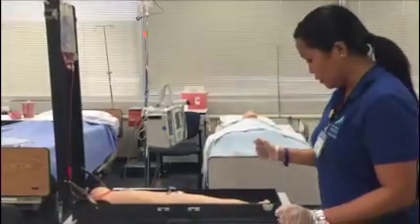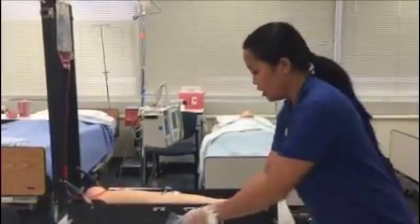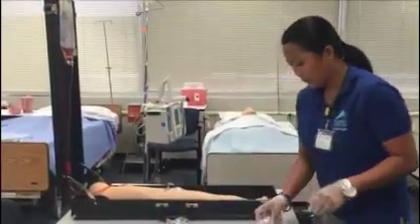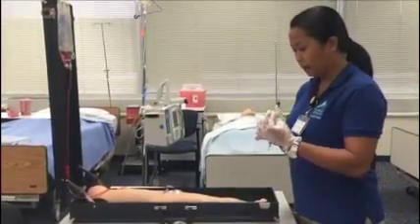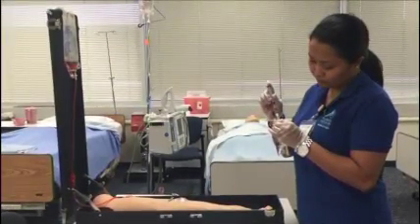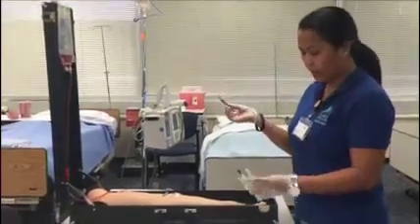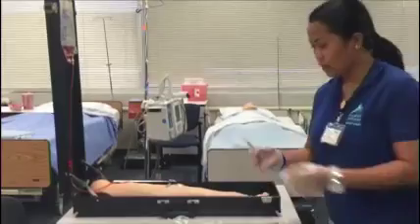I'm going to check everything. The medicine's done, and now I'm going to mix the medicine in this IV bag. All right, it is in it. I'm mixing it with the scoop method.